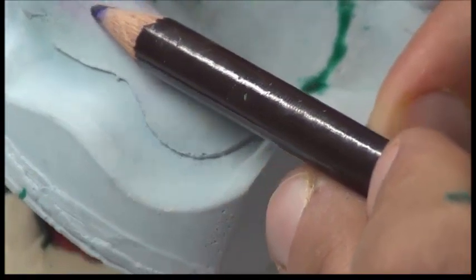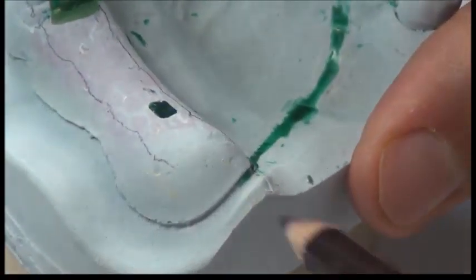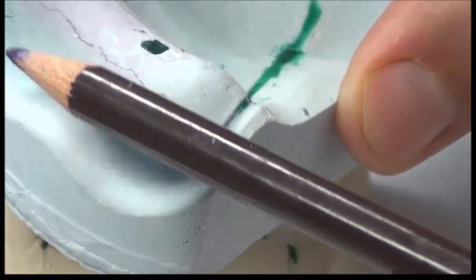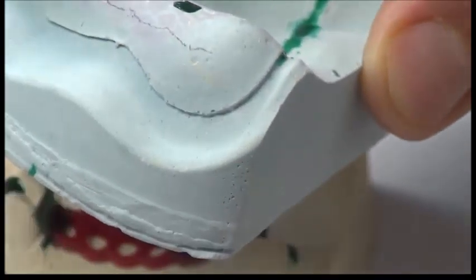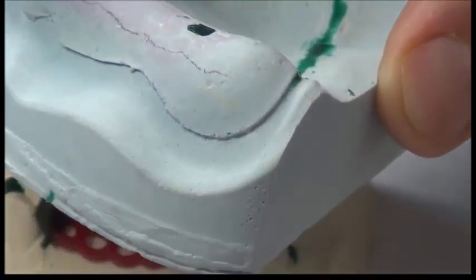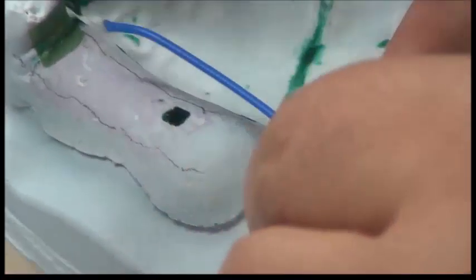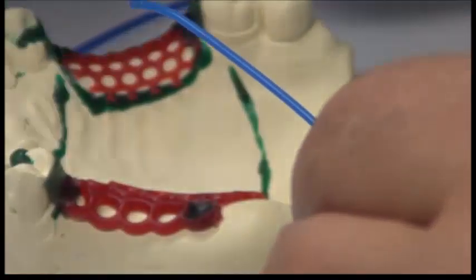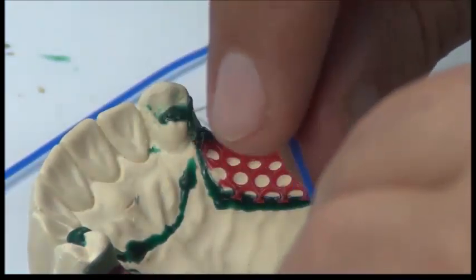If I draw a line from the marginal gingiva of the tooth here, posteriorly, imagining where the molar marginal gingiva will be, the first layer of relief wax placed on the secondary was around 5, let's say 6 millimeters beyond this marginal gingiva. Now if I want to place an external finish line, my external finish line will be the area of contact of metal with acrylic. So my external finish line, first of all, is not over the relief immediately, it's over the metal framework. It's a piece of wax in the shape of a roll or a rod. It's a piece of wax, also pattern wax.